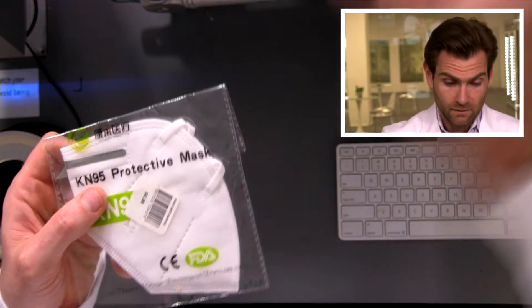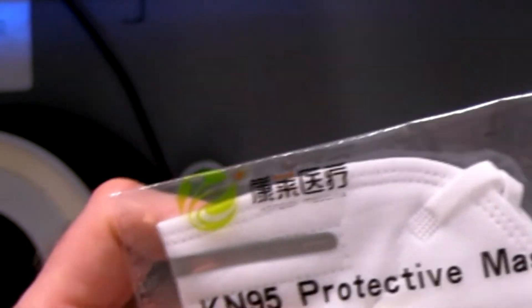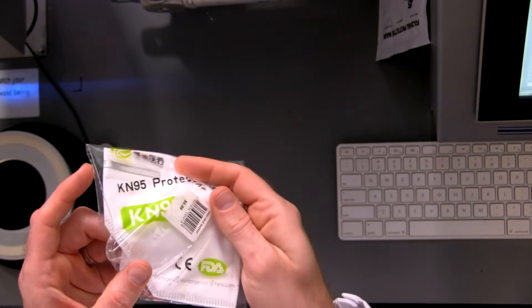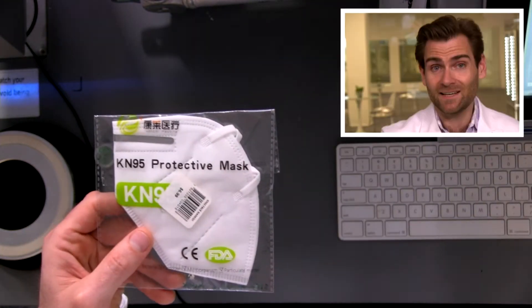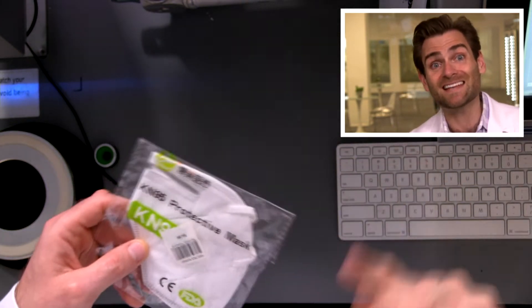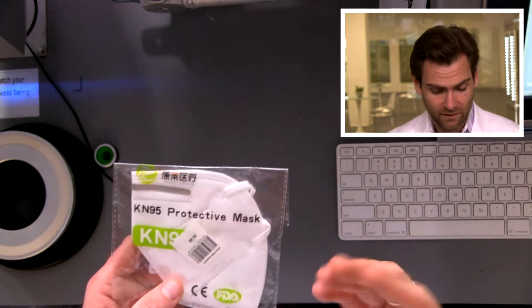This one is from Hanglai Medicine. I looked at this and I was like, this is fake. Number one, KN95 format doesn't just say KN95 on it — it says GB2626-2006, which is the standard that KN95 is held to. That's got to be on the actual mask, and it's not on this mask.